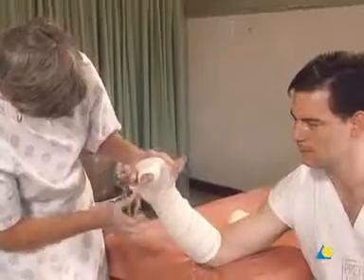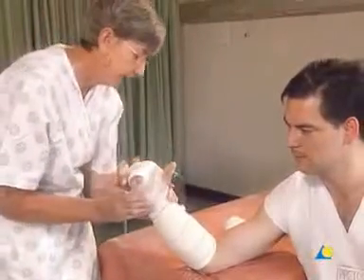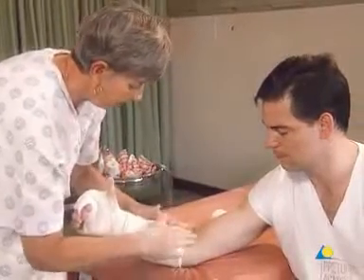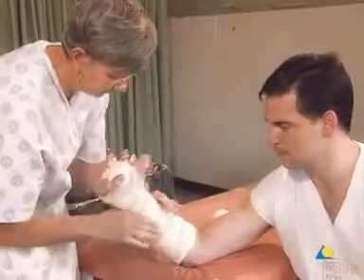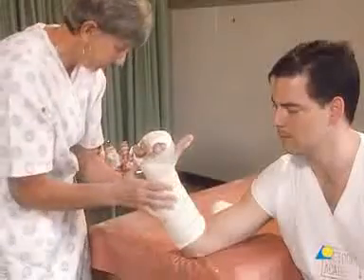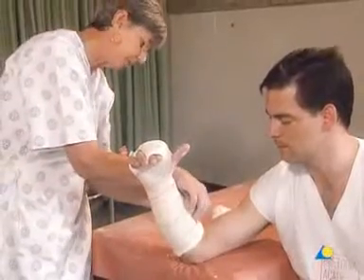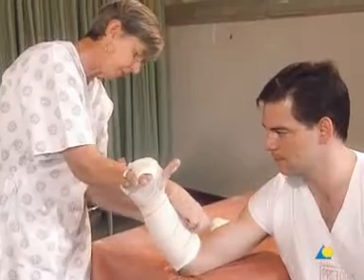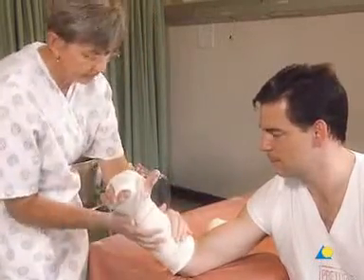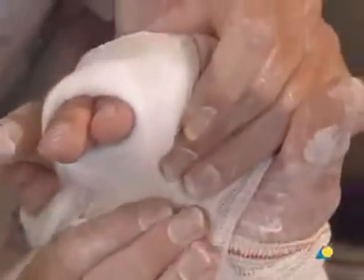The cotton wool is folded over to provide a softer edge. The application of the radial gutter splint is now complete. The reduction may be verified with an x-ray.